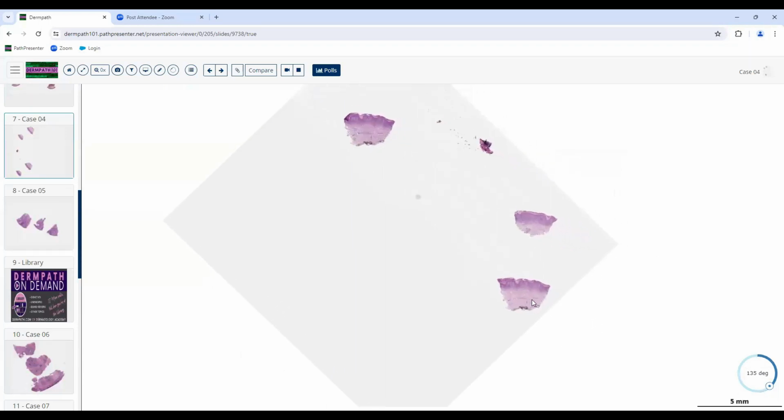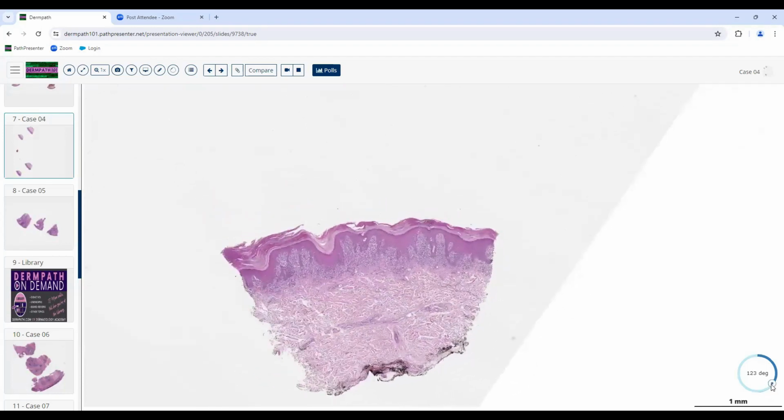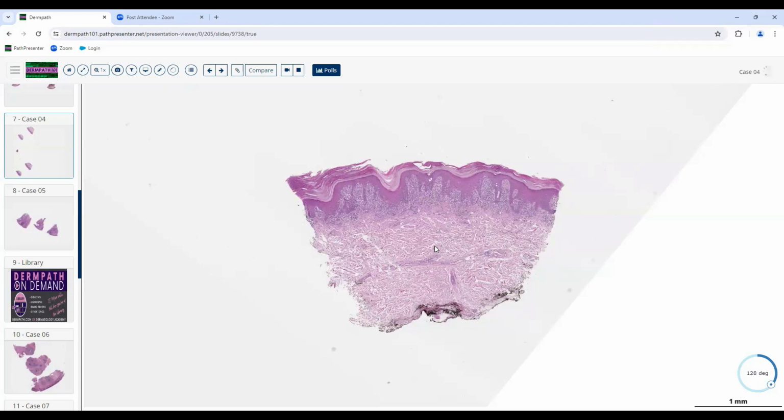So we have a punch here. Looks like we're dealing with a rash. Rash always makes my skin kind of crawl a little bit as a dermatologist. I mean, everybody says rash, but to me, rash is more of a layman's term, like mold. I always say cutaneous eruption or inflammatory skin disease, something like that. We have to have some way to speak in our own little lingo that the patients can understand.